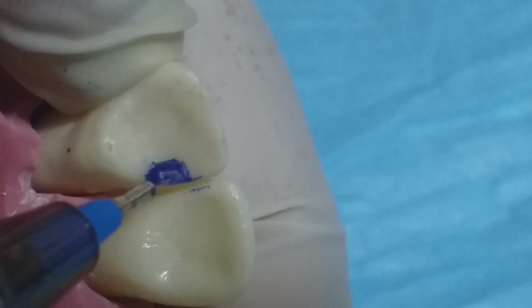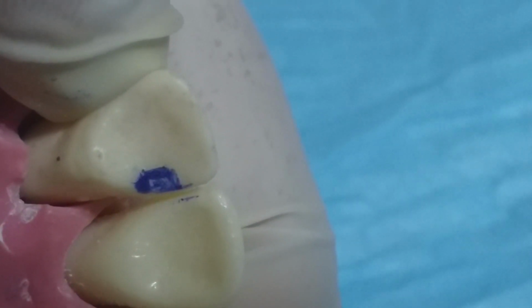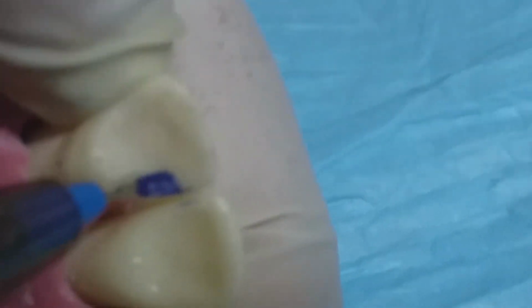The incisal wall and gingival wall will extend from 1 millimeter to 1.5 millimeter in width. We will make the preparation in depth by 2 millimeter, different from all classes.